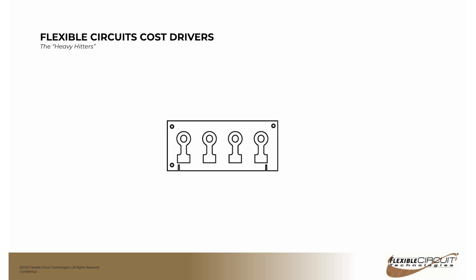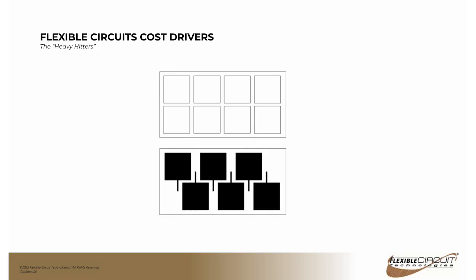This is just another example. If you had just a square rectangular part, you can see how they panelize by adding a single arm coming off one side. You reduce it by 30%, so it's an expensive arm. In a case like that, you could probably do that connection with a single wire, and even though it's a hand operation, it might be cheaper to do that. So it is kind of a balancing act on how that goes.